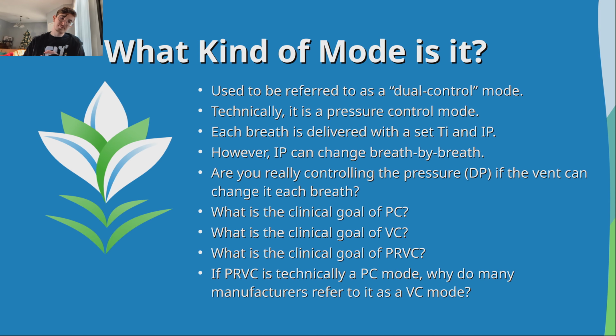And technically, it is. All right? Each breath is delivered with a set inspiratory time and inspiratory pressure. That is the definition of pressure control. Flow and volume vary. That is pressure control, technically speaking. However, your inspiratory pressure changes breath by breath. Are you really controlling the pressure, driving pressure, if the vent can change it each breath?